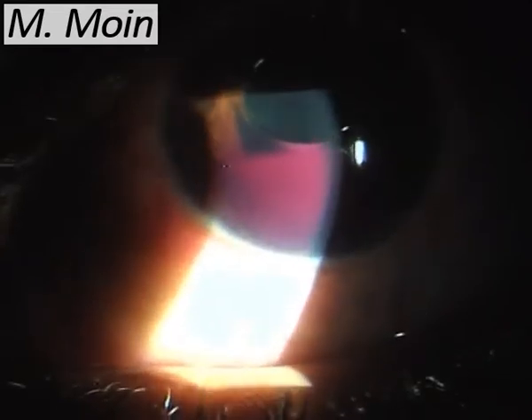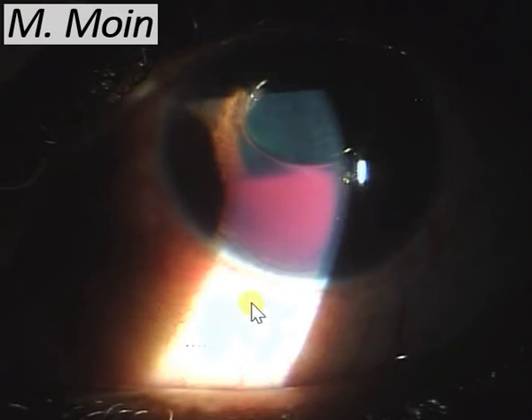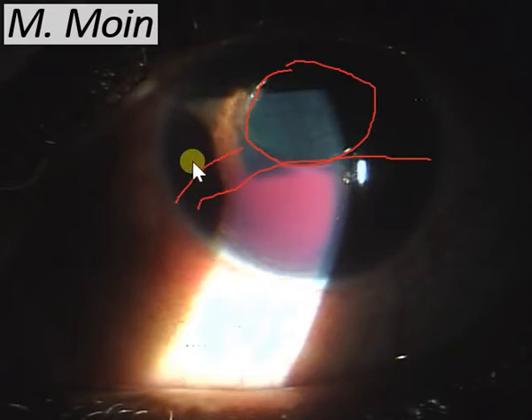So what we are going to look at today is a very scary finding which you can get in a patient after trabeculectomy, which you never want to see in your patients: hyphema. But this is something which can happen because patients do get hypotony after trab. Although I have injected air over here, you can see this air bubble. This was specifically to prevent that post-op hypotony. But this is a hyphema. The important thing which you want to see is the iris seems to be curving like this. So this patient had a very shallow anterior chamber post trabeculectomy.